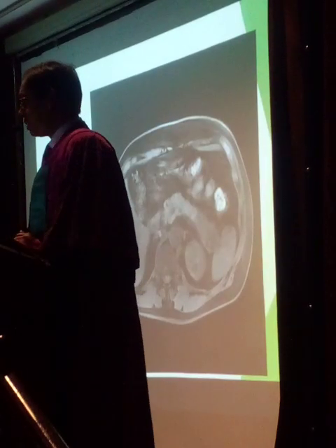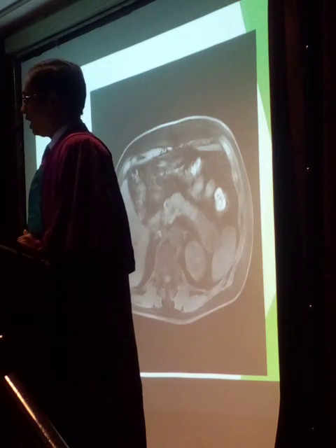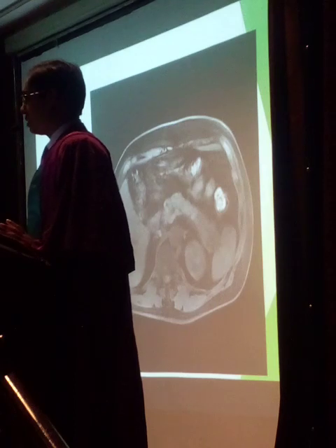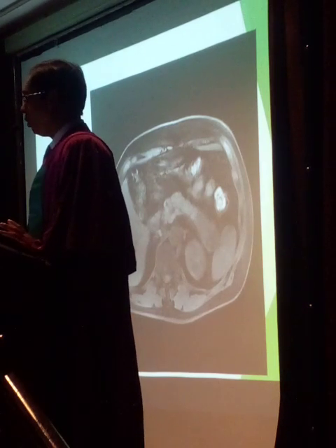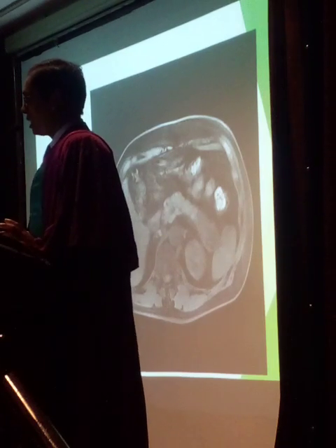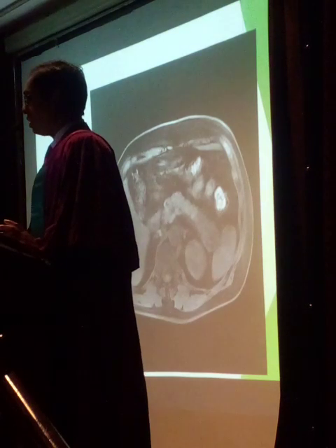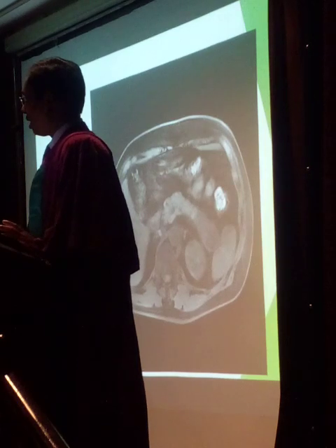Okay, next one is MRI, which is more advanced than CT for imaging the local disease, not metastasis. It's actually for the local disease. So we have to think about the indication, because surgeons request the tissue planes where it invades and whether they can go through it and take it out without harming.